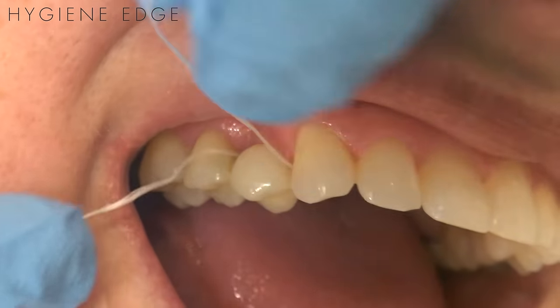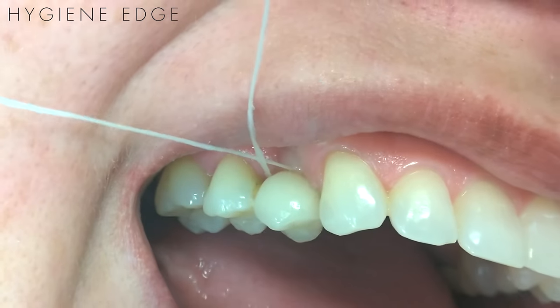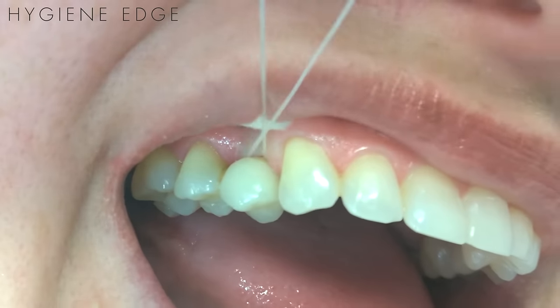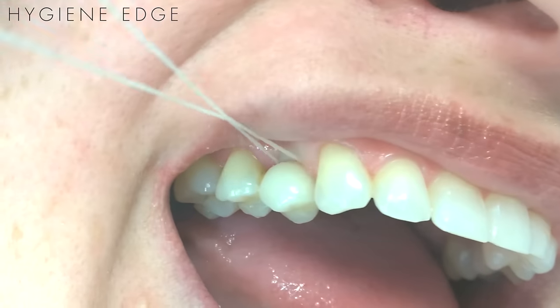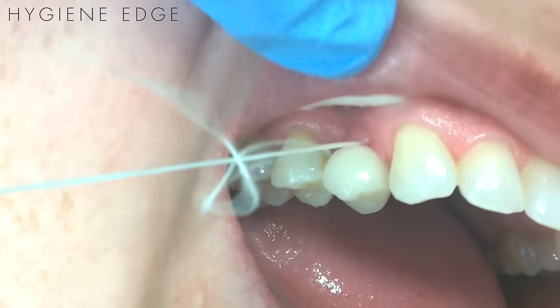When you floss the implant, take one end of the floss through the distal, and then one through the mesial, and then criss-cross the floss, and pull alternating ends on each side, shifting from the mesial and then to the distal for full coverage. This will clean around the entire neck of the implant.